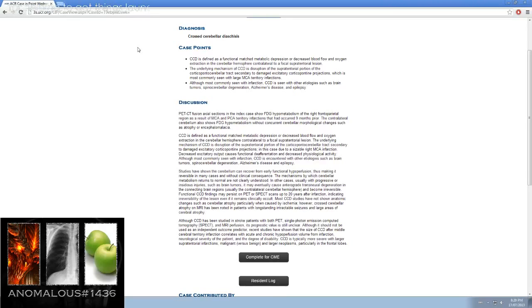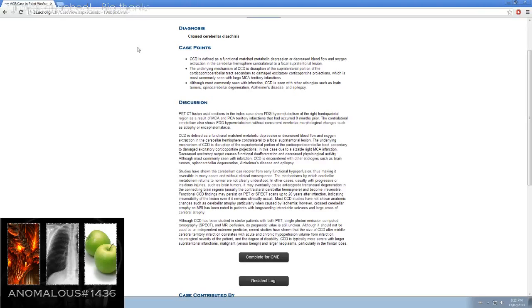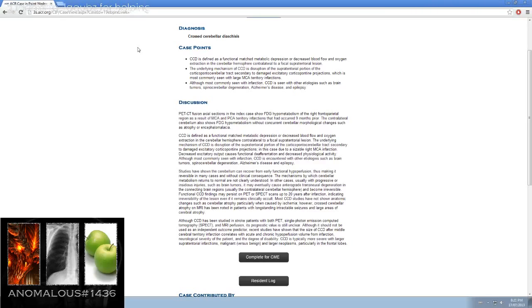CCD is typically more severe with larger supratentorial infarctions, malignant versus benign, and larger neoplasms, particularly in the frontal lobes.